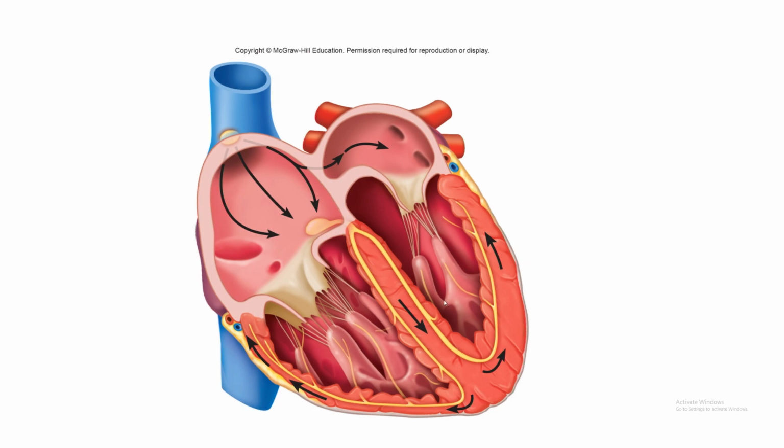And you may be thinking, why is there another upward deflection if it's becoming more negative? When it goes down, that would just make sense. Because like your QRS, that's everything becoming more positive, right? It's depolarizing and it's an upward deflection. And the reason why it's in the same direction, even though it's becoming more negative, is because of the way your 12 lead setup and the charges of the electrodes work, right?